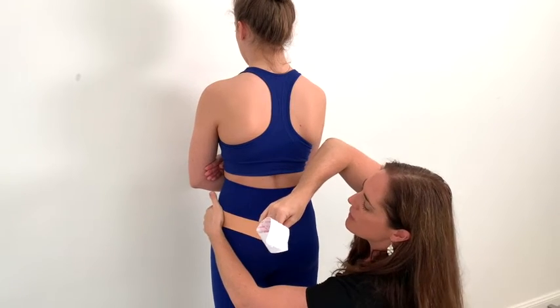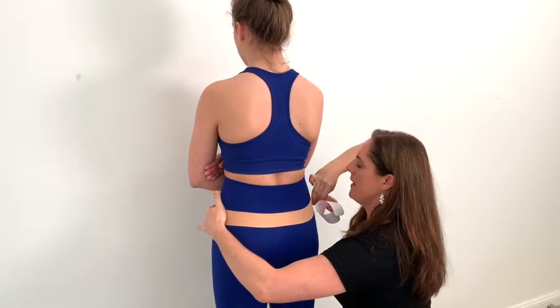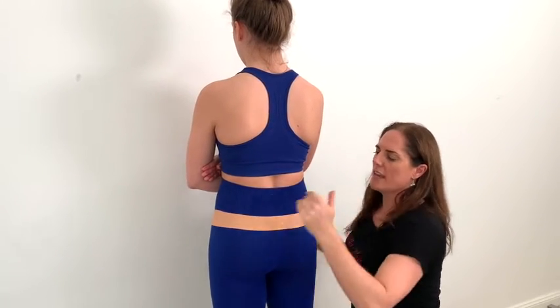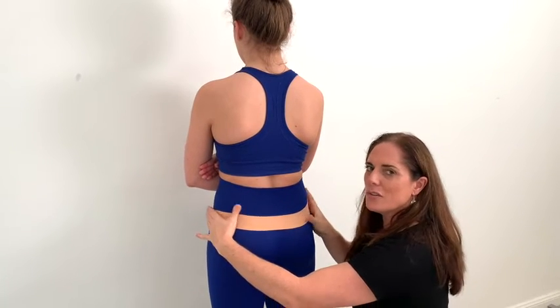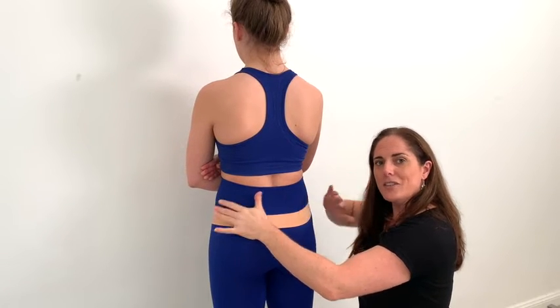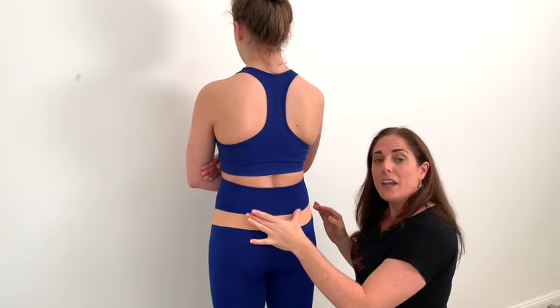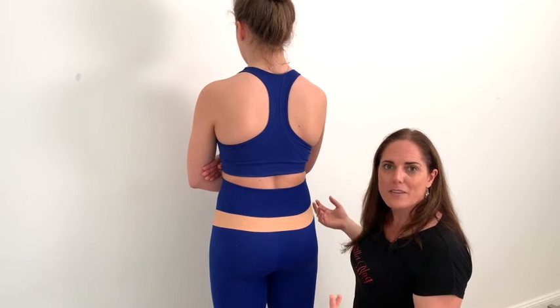I use one hand to hold it back, bring this slightly down and then back up, and attach the anchor on the other side. This just gives a really nice gentle compression around the back of the pelvis — nice and quick and easy to do. If this gives any pain through the back, take it off immediately. If it's the right one for you, you'll feel an instant release when you pop this one on.